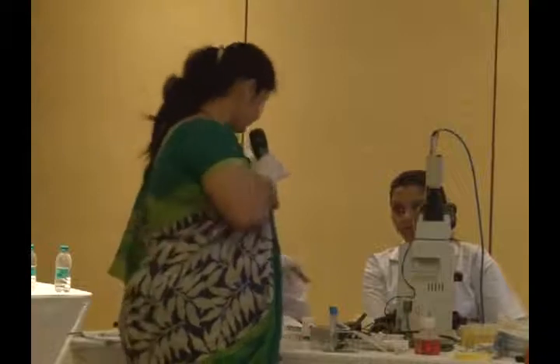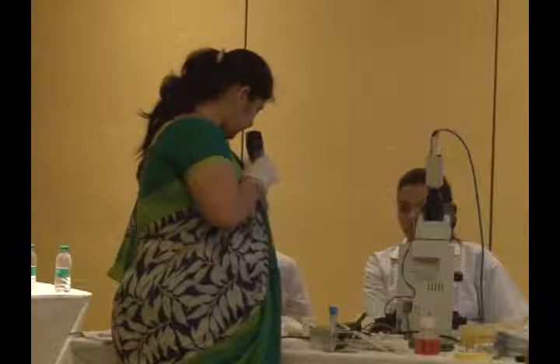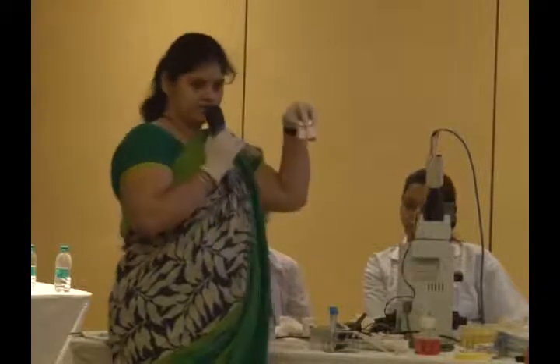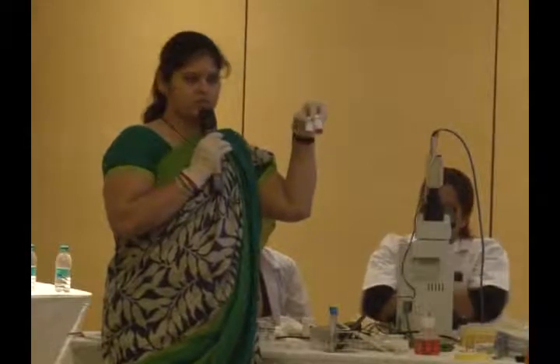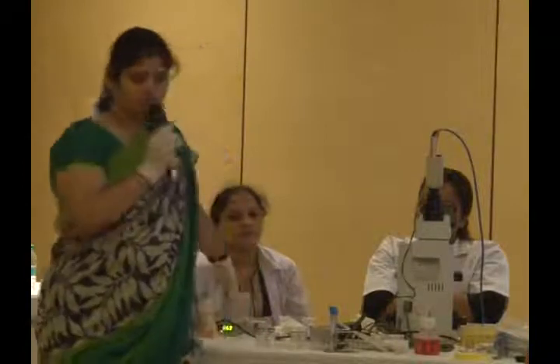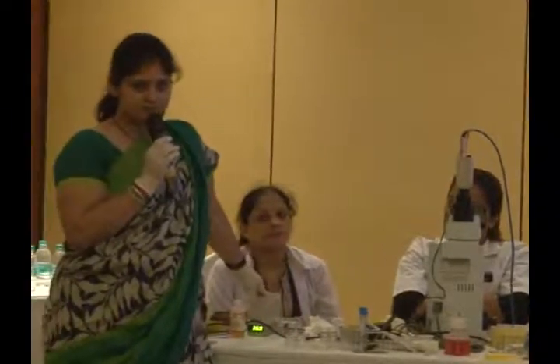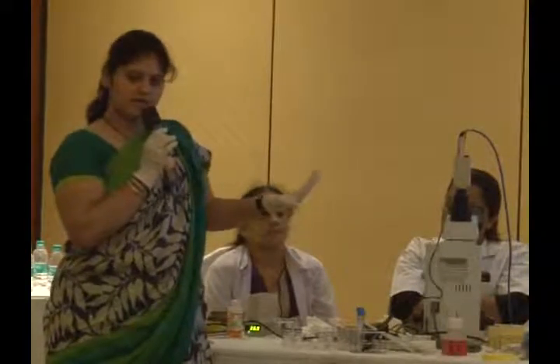Right? Here what we use is, we have two options. One is 40-80 and one is 55-80. These are readily available. We just have to prepare the tube and you can use the medium. Now, you will also need a heating block for the swim up. So this is the setup which you require for the IUI.